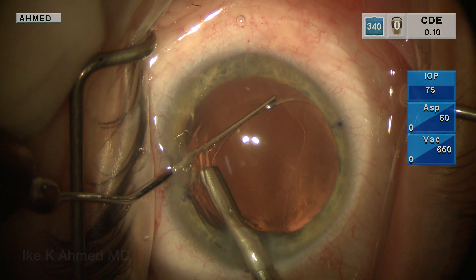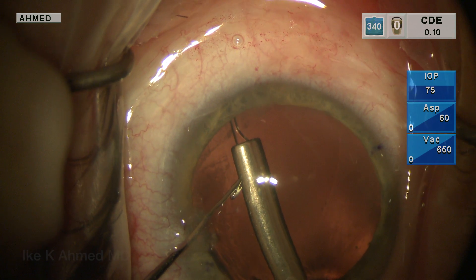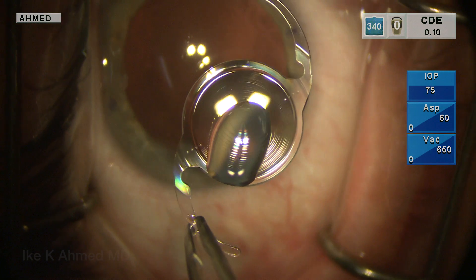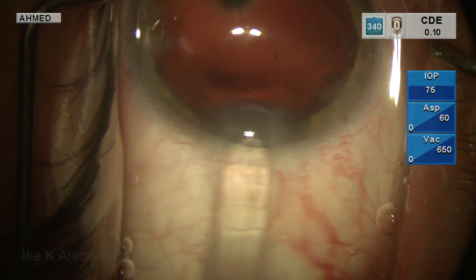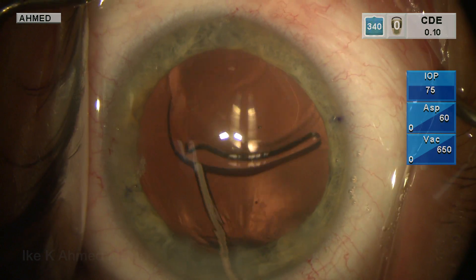She also had around two diopters of with-the-rule cylinder. As you can see, we've marked the cornea on the steep axis of the intended placement of this multifocal toric lens. As you see here with this pupil-independent single-piece acrylic multifocal lens, this lens has two and a quarter diopters of cylinder correction on the IOL along with this multifocal design.